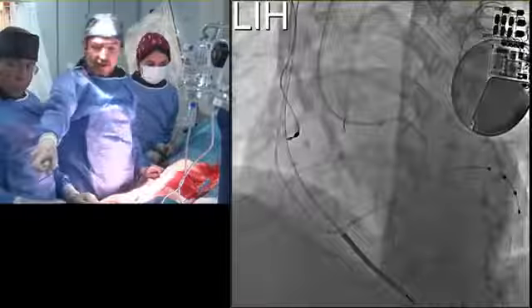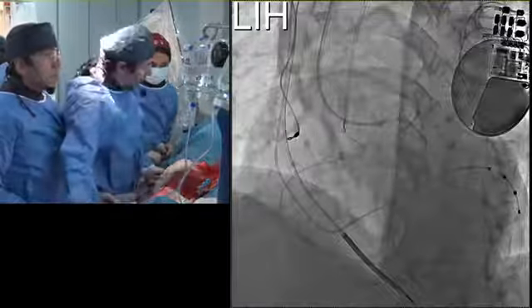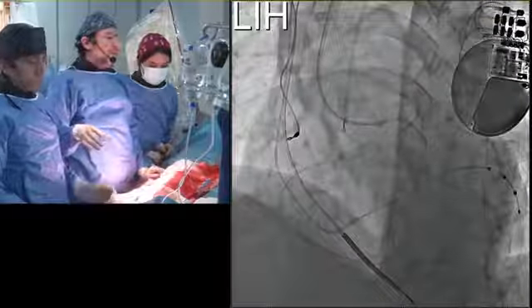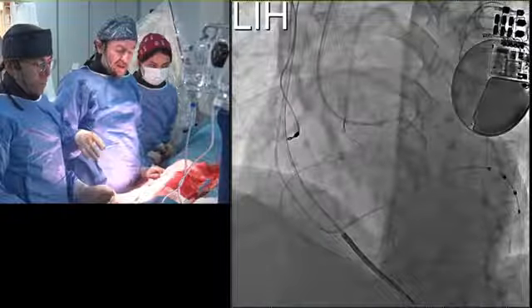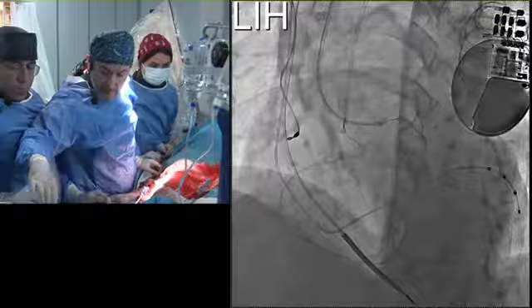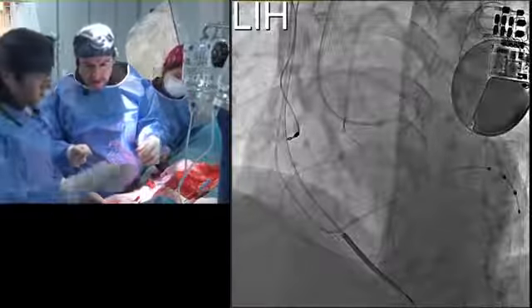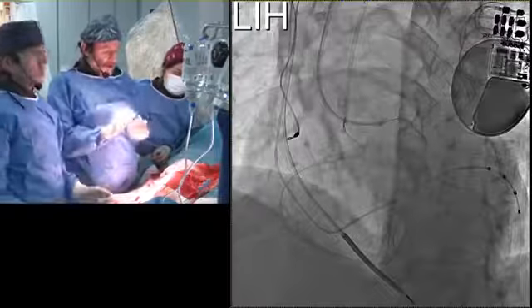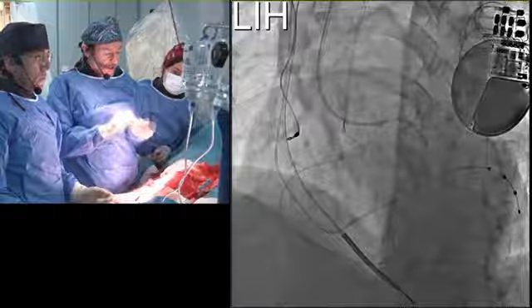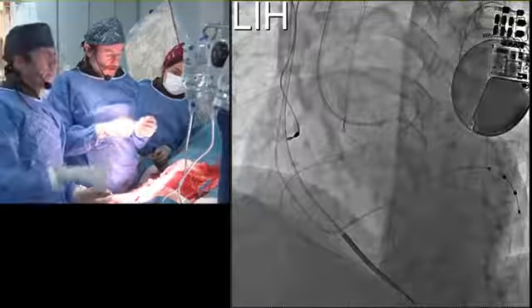Bana bir şey versenize. Bana bir P3 veya Enrich 03 var mı orada boşta? Şevket, we have 2 lectures. Yeah. We will leave you for a while and then we'll come back. I will put a third wire into the aorta just to prevent the sucking of the guiding catheter into the left main. You record everything in the pictures and show us later. Excellent job. Yeah, okay. Yeah, thank you very much. Bana şey verin. Okay, Şevket, we will give you 1 more minute and after that we will go for lecture. No, you can go for the lecture. I'm still doing. I will update you after the lecture. Okay, thank you.